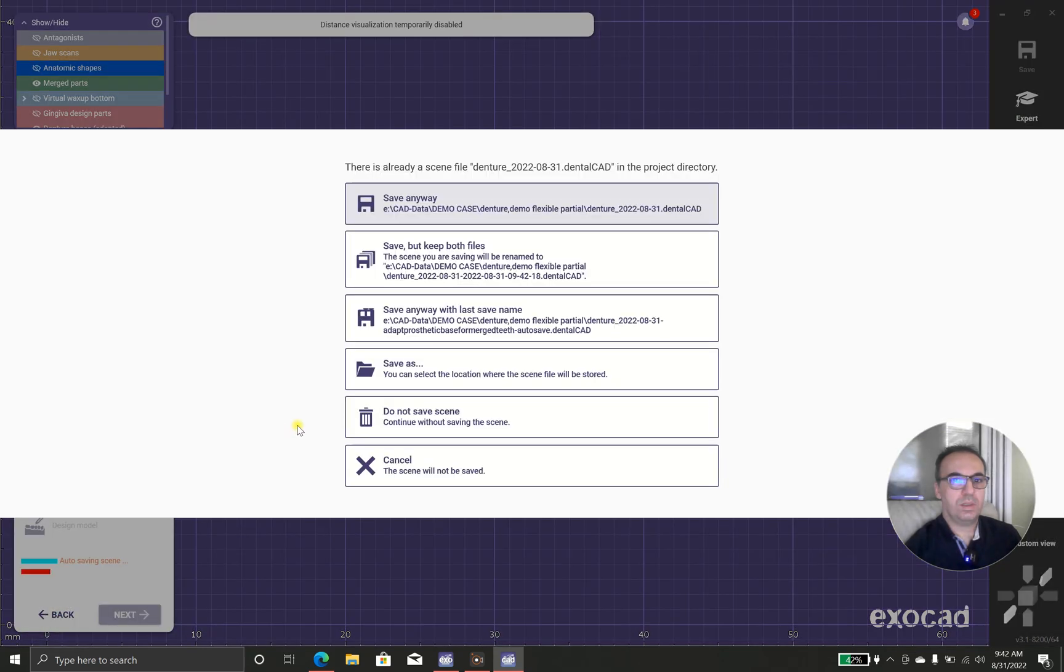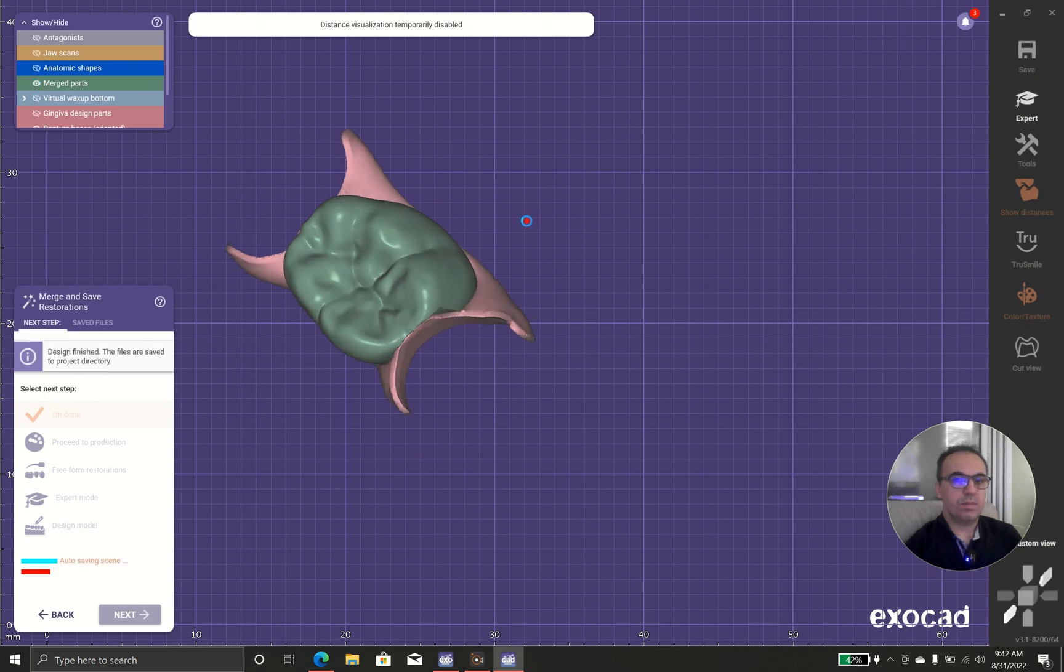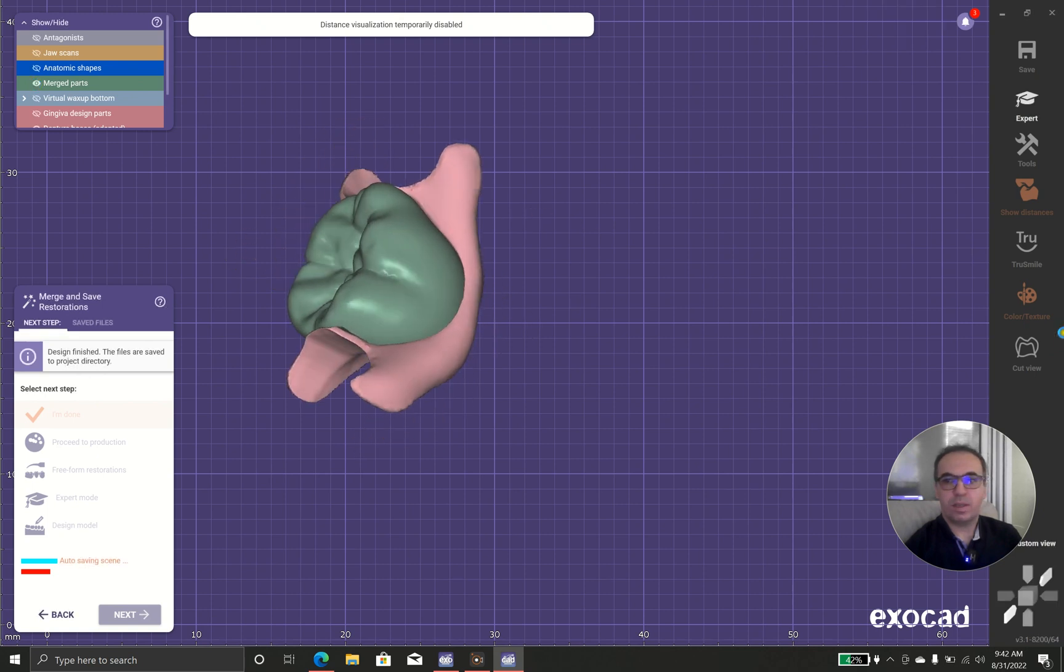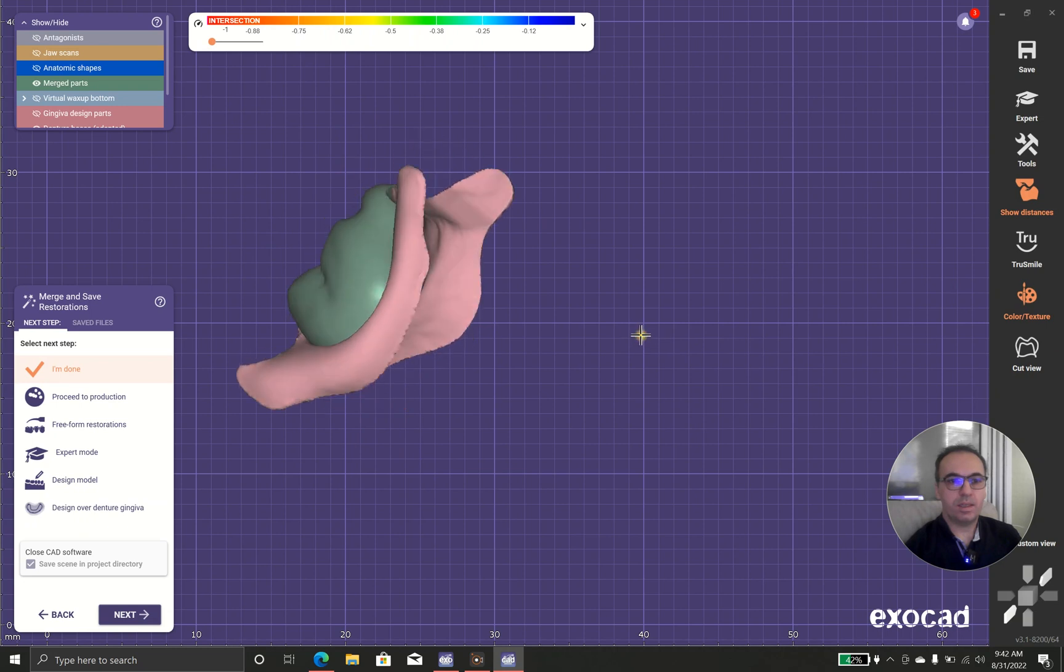Okay. Now as you can see, there is no gap between the teeth and the base.